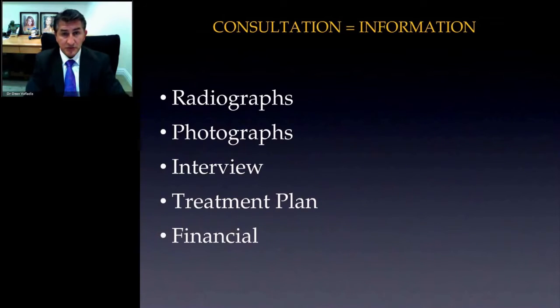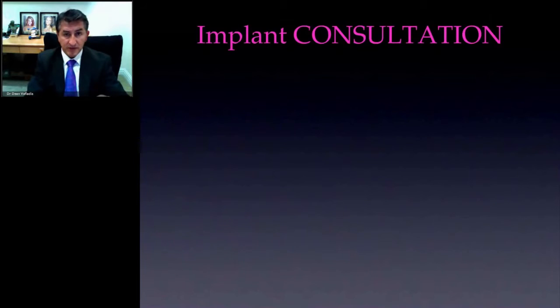At the consultation, we'll do our radiographs, photographs, and our interview with the patient, really sitting down and trying to get to know them. It's not done in the operatory; it's done in a separate office in a private setting, and that gives the patient more time to discuss their issues and what's happening. And we give them the treatment plan and the financials.